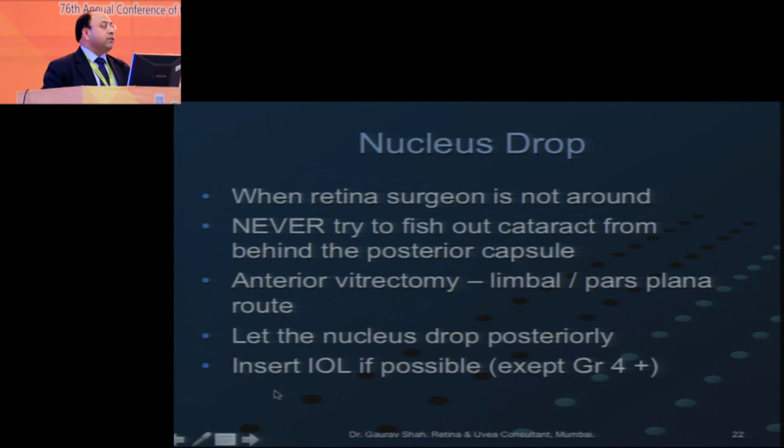And for the intraocular lens, you can implant it either in the sulcus, or if there is enough posterior capsule, in the bag. If it is not a very dense cataract, please go ahead and safely introduce the intraocular lens at that time, ensuring that you are not pulling onto the vitreous, because a retina surgeon can handle removal of the nucleus, except if it is very dense brunescent, through a phragmatome, through a sclerotomy, and we usually do not use the anterior route.